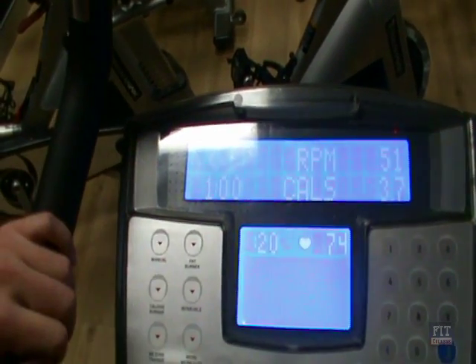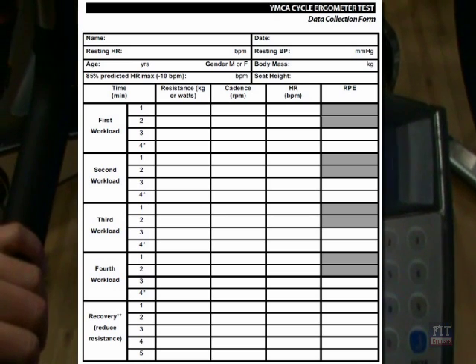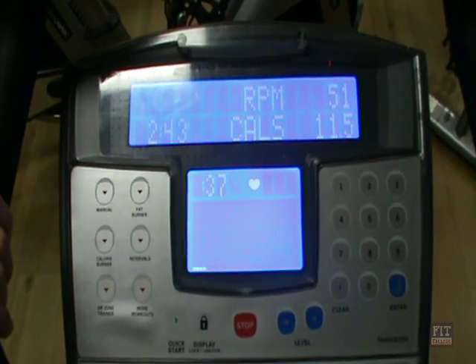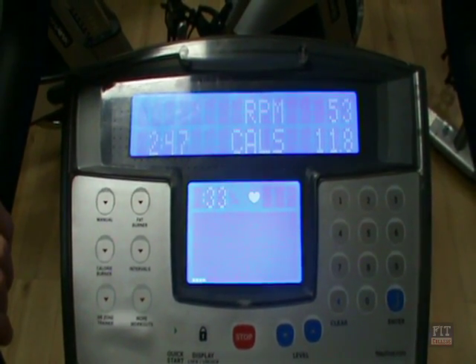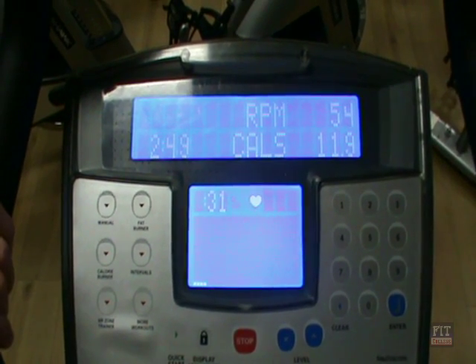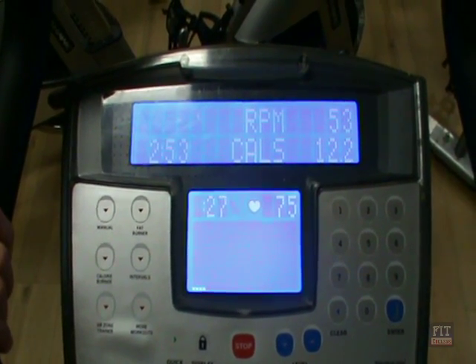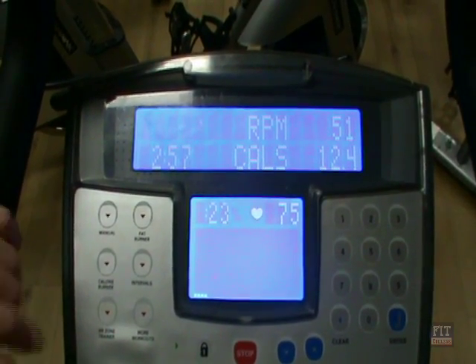We can now see that our client has a heart rate of 74 at the minute mark, so using your data form you will now record the heart rate. We are coming up to the third minute now, which is the end of the workload. As long as the heart rate has not increased more than 5 beats from minute 2 to minute 3, that will move on to the next workload.